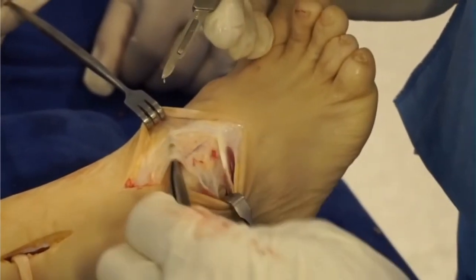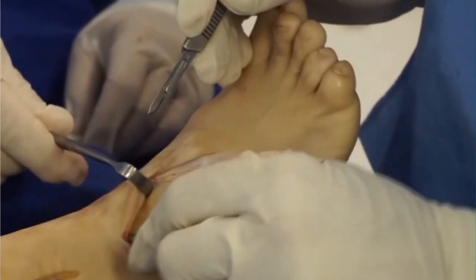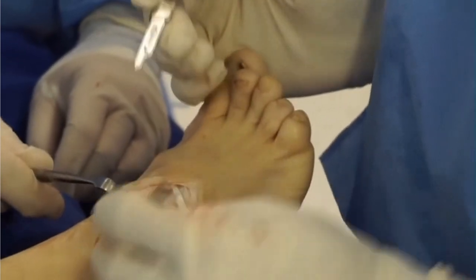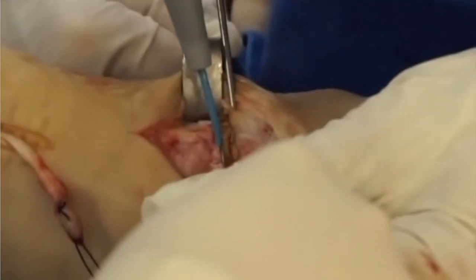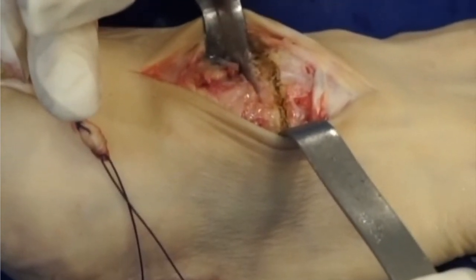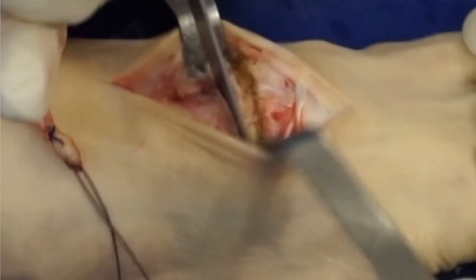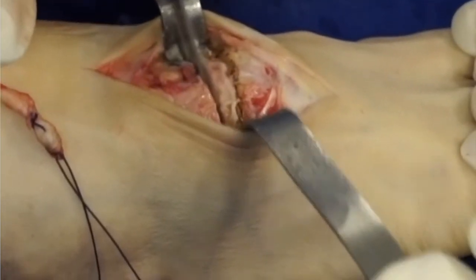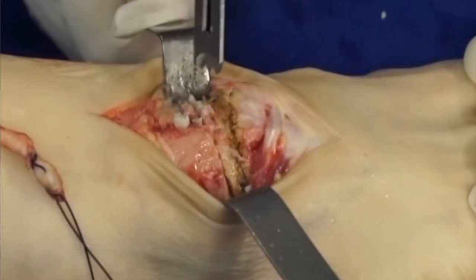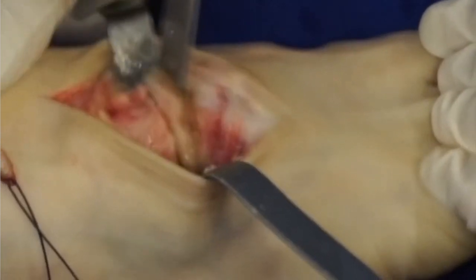Now we go dorsally. On the dorsal surface of the foot, I'm going to find the superficial peroneal nerve and its branches, as well as the deep peroneal nerve, which is being retracted. You can see the extensor hallucis brevis in the distal aspect of the incision. I'm going to cut straight down onto the periosteum and use a guide pin to mark out the osteotomy with electrocautery. This is usually at the navicular-cuneiform joint, where I'm going to remove a fairly large wedge, dorsal and medial, but no wedge is taken out at the cuboid — this is a straight cut into the cuboid. If you haven't done this procedure frequently, I suggest making two incisions and doing the cuboid osteotomy separately rather than trying to do it as one cut extending from the dorsal central aspect of the foot all the way over to the cuboid.